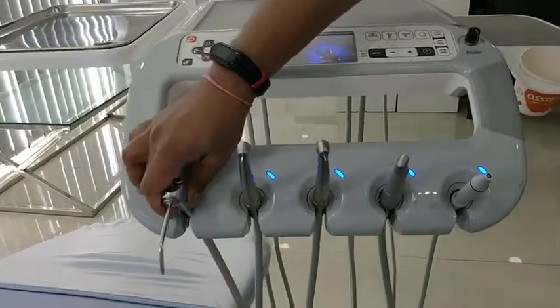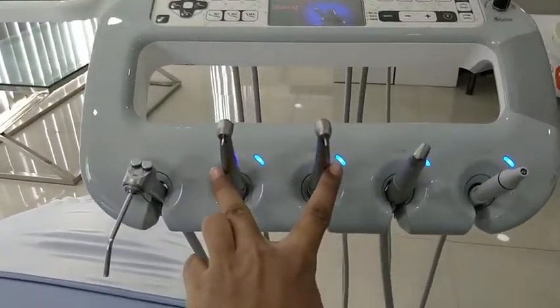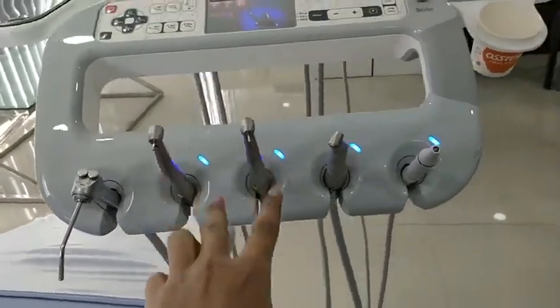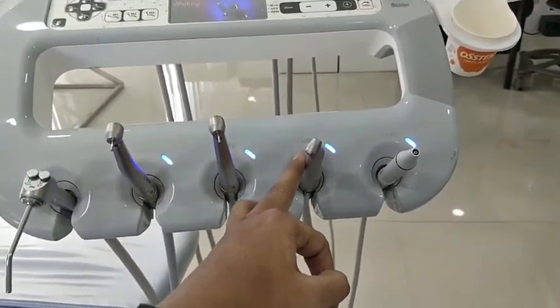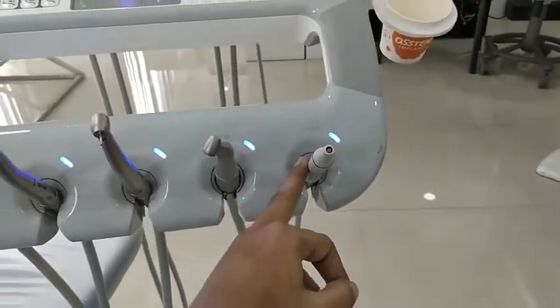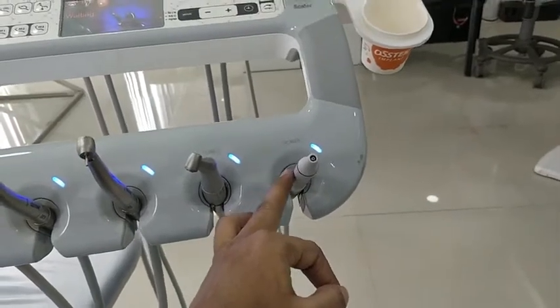We provide two fiber optic air rotor handpieces manufactured by NSK Japan, an air motor with straight and contra handpieces also manufactured by NSK Japan, and an EMS scaler with a type tip manufactured by EMS.